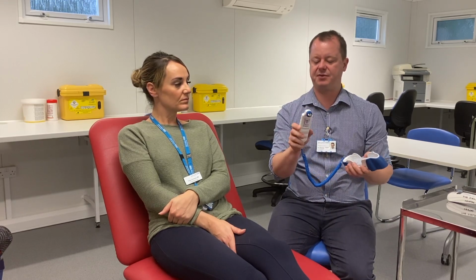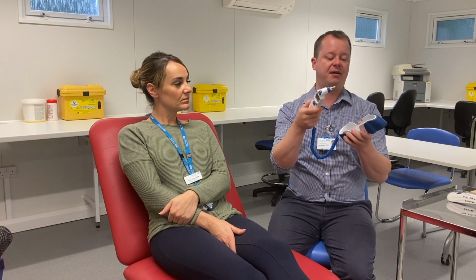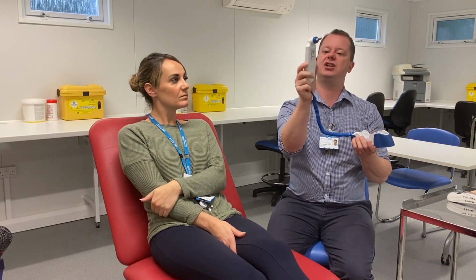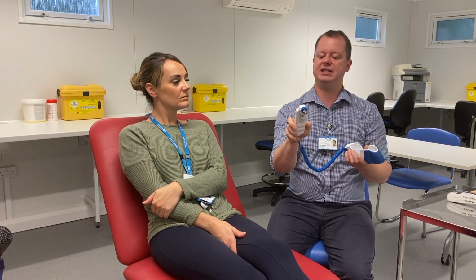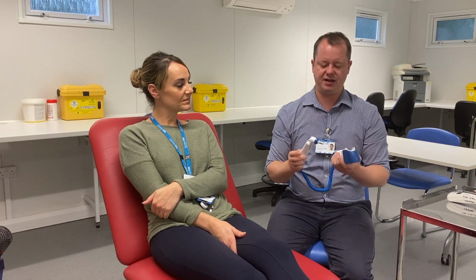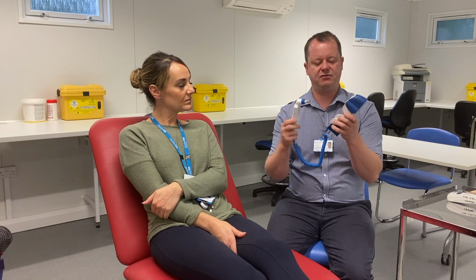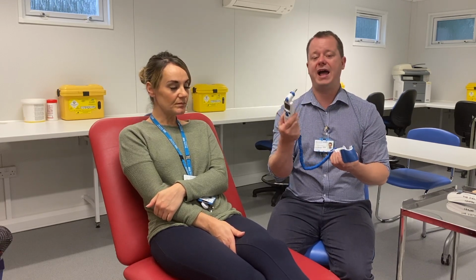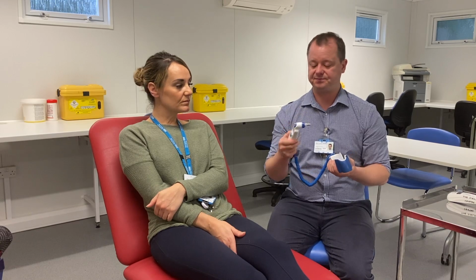So most tympanic thermometers, the ones we have, are attached to obs machines, which we'll show you later. But this one, for example, when you pick it up, it actually looks like it's turned off and the screen is blank. There's a few buttons on it with a great big triangle button, which is the button that's going to take the temperature. And inside the actual box that it comes in are covers that when you put one of these covers on, will activate the thermometer and turn it on.